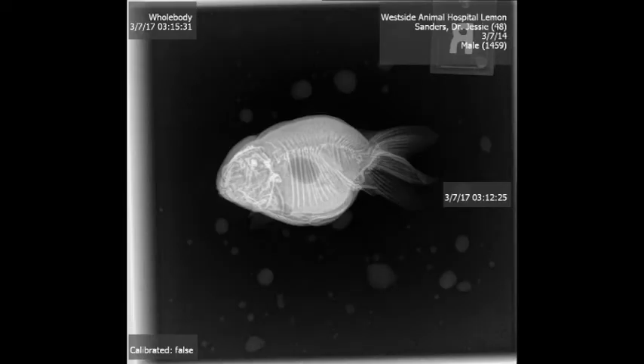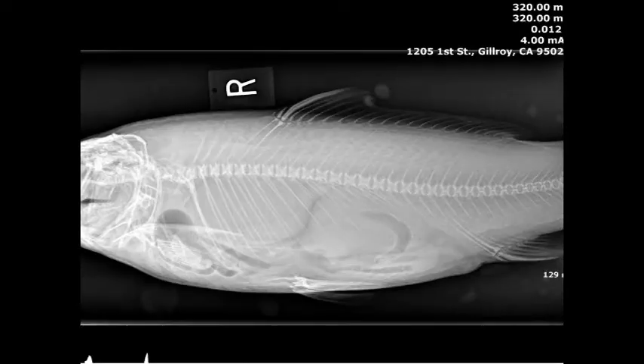You probably have met Lemon on one of our other YouTube videos. These radiographs were taken after she developed a negative buoyancy disorder, trying to figure out if her swim bladder was insufficient. Unfortunately for this fish, she did only have one chamber of swim bladder, which makes it a little bit harder to float — meaning that her negative buoyancy disorder was permanent, but she had a good life otherwise.